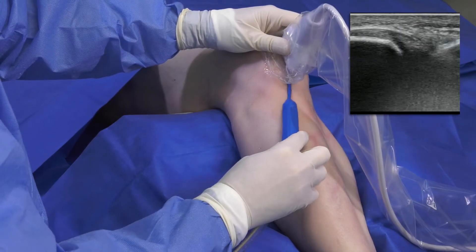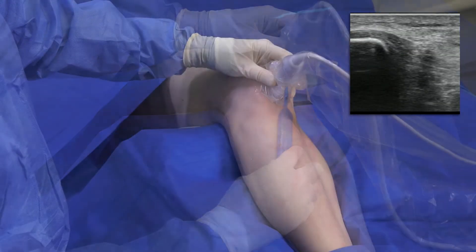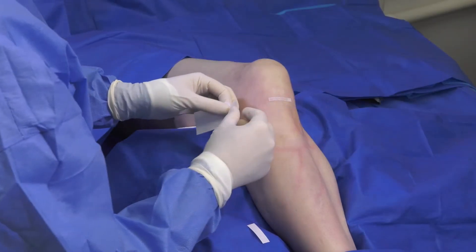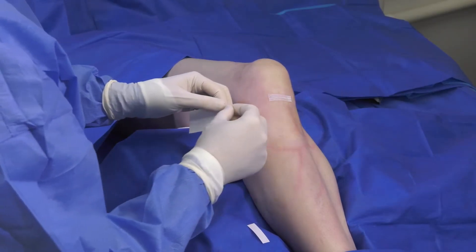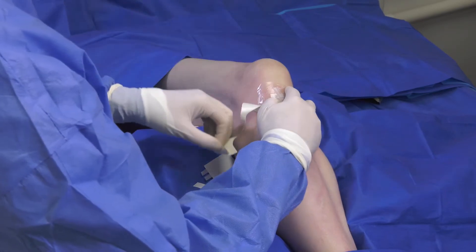After approximately three to five minutes of debridement with TenJet, I scan the tendon again to confirm that I have debrided all the diseased, pain-inducing tissue. Since this procedure is performed through a stab incision, there is no need for sutures. I place a Steri-Strip which is then covered with a Tegaderm or bandage.